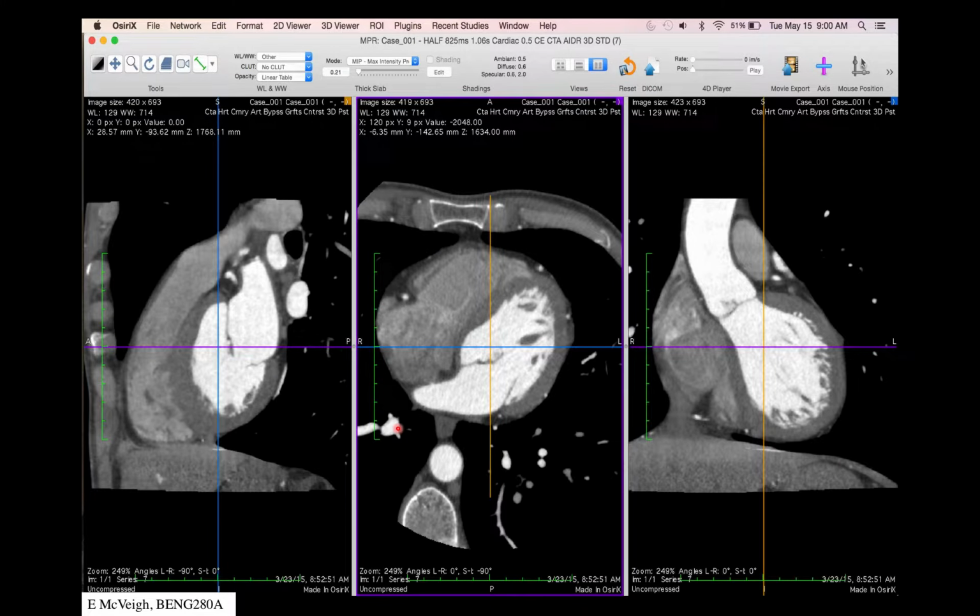Here's an example of CT volume of the human heart. And again, it has contrast in it. And so this is the left ventricle. You can see the left ventricular blood here, right ventricle over here, the coronary arteries. One is here, one is here. Atrium, left atrium, aorta. This is the descending aorta.